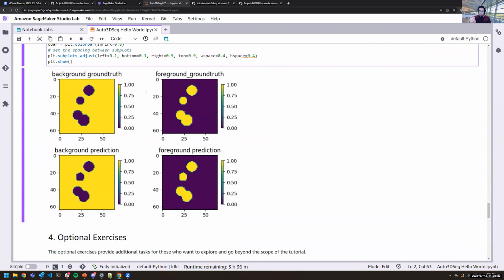And you can see that there is a little deviation on the bottom circles in particular, that the edges aren't as clean as the actual ground truth, but we only trained for 1 or 2 epochs. We didn't train very much on it, although the data is fairly simple. And this took about 2 minutes, where it'll load the data, go through each of the networks, run the different folds with the parameters, and then ensemble and give the results back.